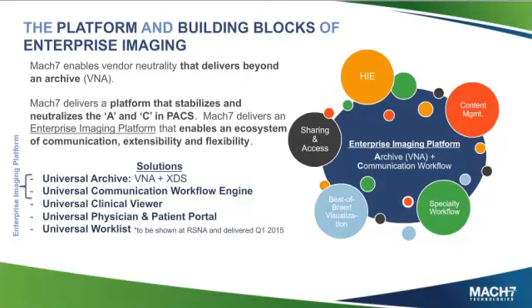Second, or thirdly, when you start talking about ILM, I would also look at your longer-term strategy of how you see your PACS and your VNA working together. When we talk ILM, certainly I think most institutions aren't going to be deleting anything for at least 7 years. And obviously if it's mammography or a pediatric case, it could be longer than that.